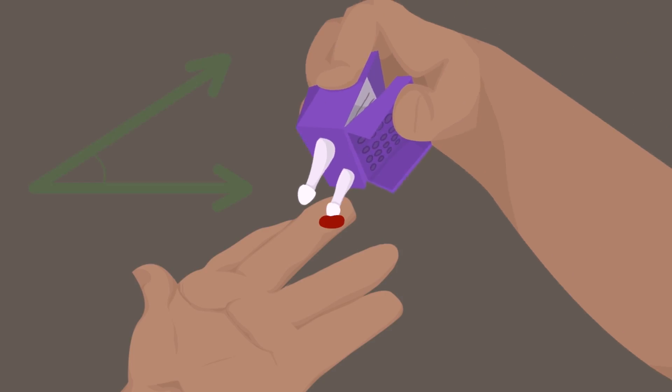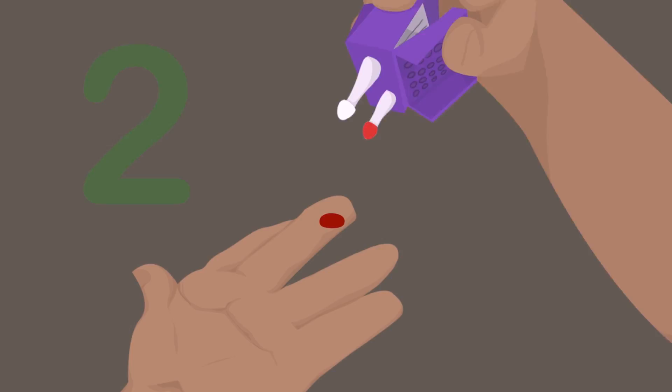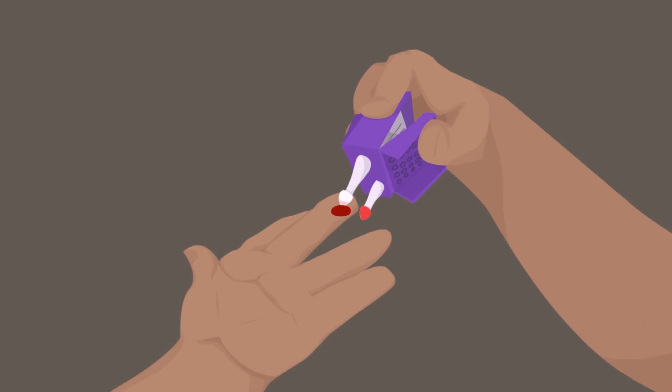For proper sampling, take the blood from a positive angle. You'll do this by applying the microsampler tip to the surface of the drop of blood. Make sure the sampler tip turns fully red and then count two seconds before slowly and smoothly removing it. Do this again for the second collection.